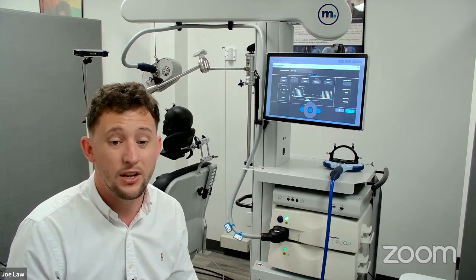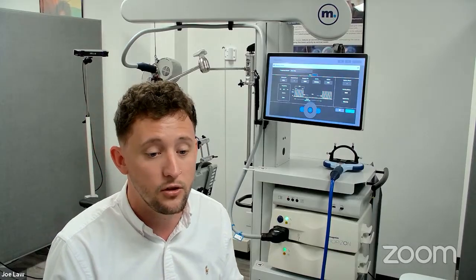If I'm honest, it usually doesn't take 2 days. We take 2 days just to make sure everybody is happy and confident with the system. But usually we see most people are happy and confident within a day of training.